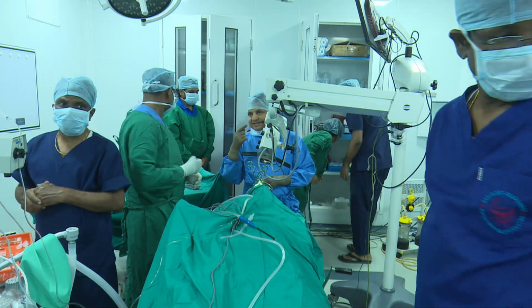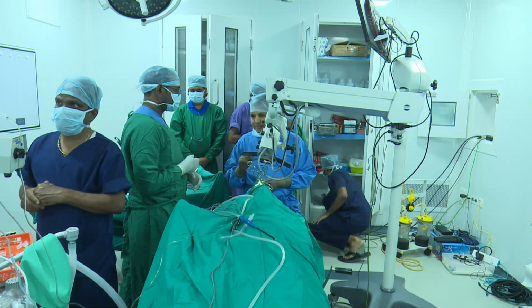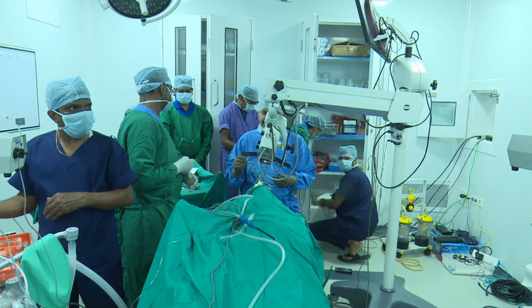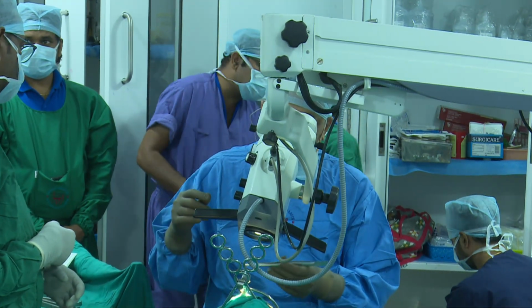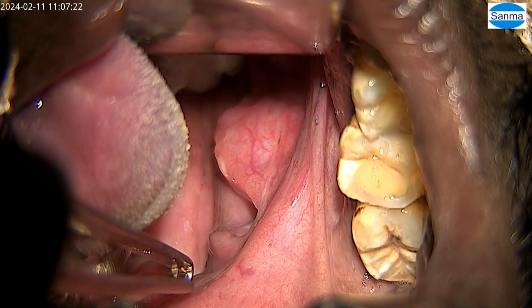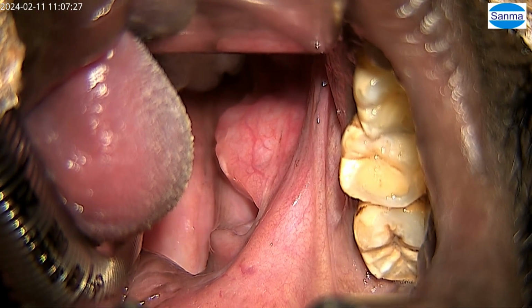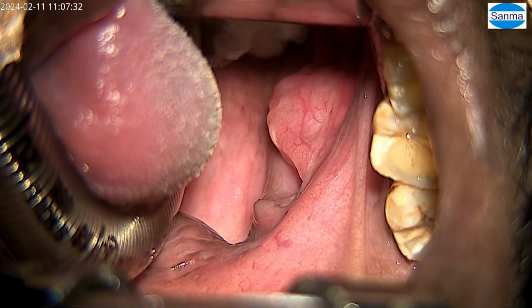All right. So, sir, allow me once again to keep my mask down so that my voice remains clear. And you understand this is an oral surgery, so sterility is not that big a problem. So, with your permission, I am keeping my mask down. And the coblation wand is getting ready. However, let me explain this case first. You have seen the DISE in this patient. It was both AP as well as lateral collapse. The AP was more prominent, right? There was no tongue base collapse. The patient's age is 38, so he has got a normal physiology, right?